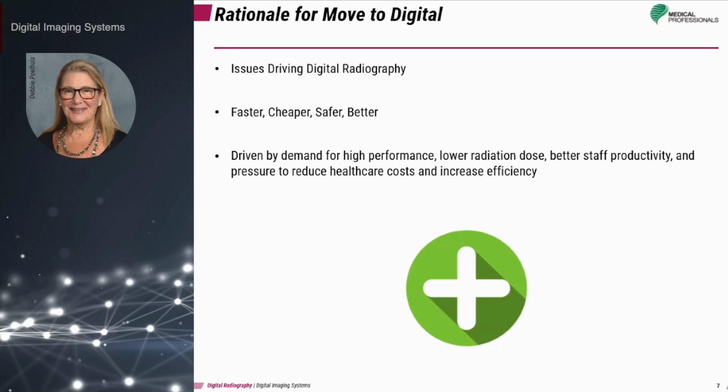Therefore, regardless of the original exposure factors, within reason, of course, any anatomical structure can be optimally visualized. So it has become faster, cheaper, safer, and better.